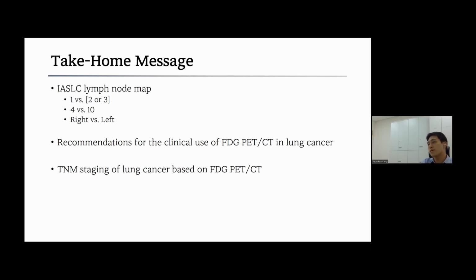And as nuclear medicine physicians, we should be able to recommend FDG-PET-CT in lung cancer patients in appropriate clinical indications. So we should know about that.